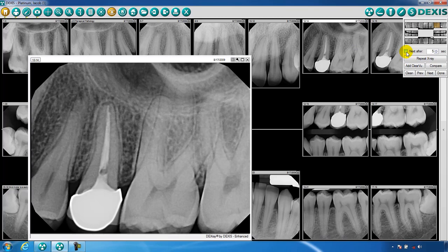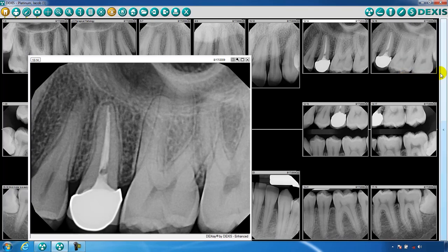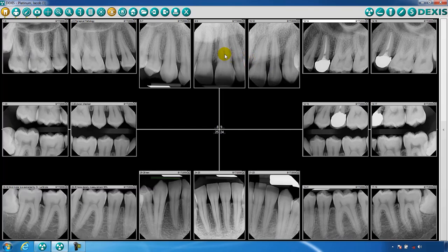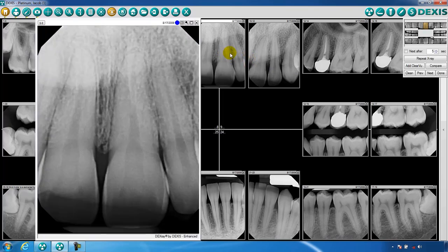Turn this feature off by unchecking it. To close the navigator, click the Done button. To bring the navigator back, just enlarge another image. This concludes the training session on an overview of DEXIS Imaging Suite's Images and Navigation.